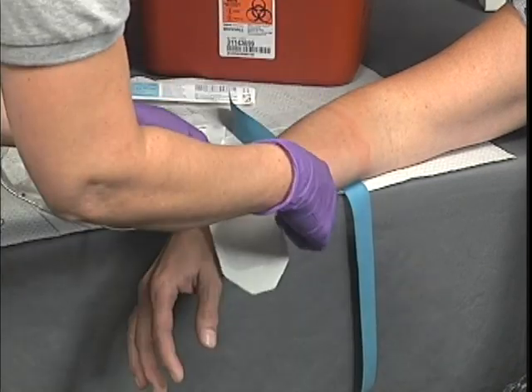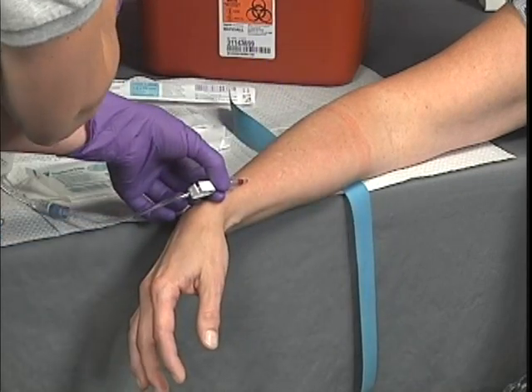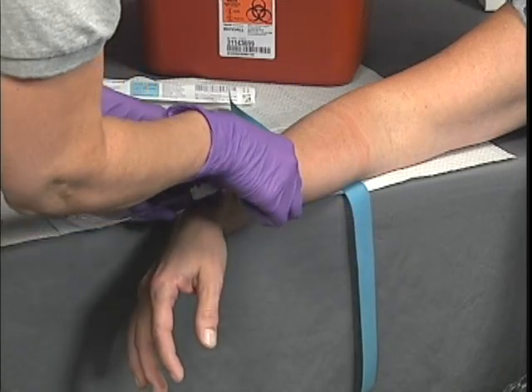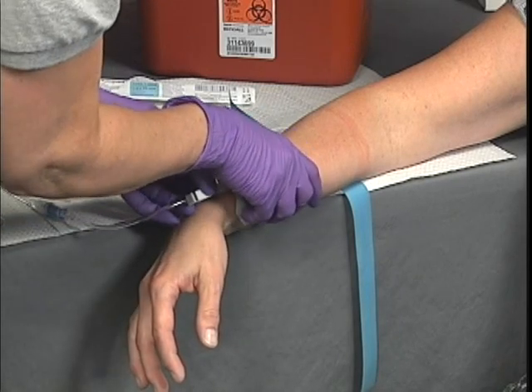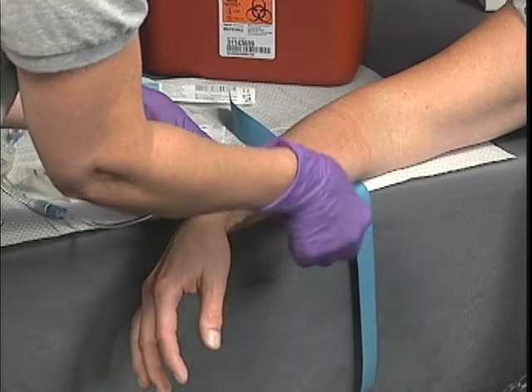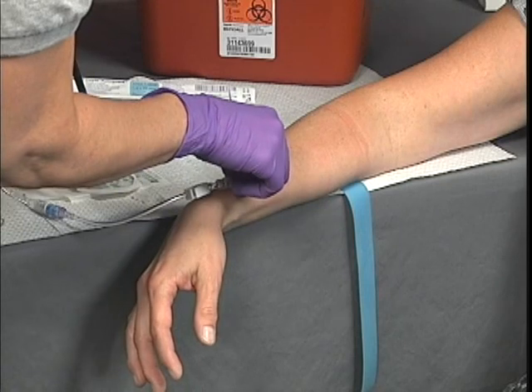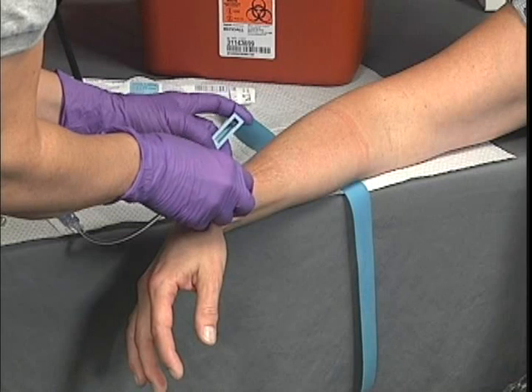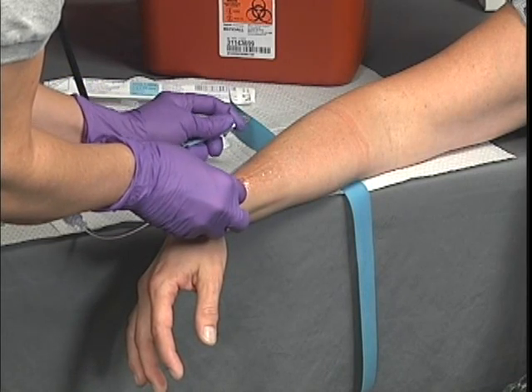After releasing the tourniquet, open the IV flow clamp and observe the flow of fluid into the drip chamber. With the IV running, and before securing the IV in place, inspect the venipuncture site for signs of infiltration. If the IV cannot be made to flow properly or infiltration is observed, discontinue the IV immediately. If the IV is observed to flow properly, use a gauze pad to wipe away any fluid or blood so the site is dry and tape will adhere. Then secure the IV and IV tubing in place.